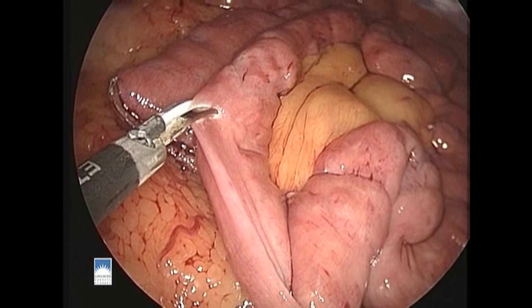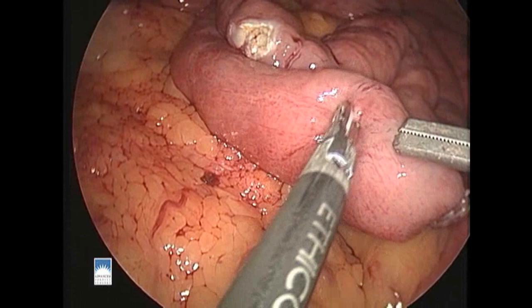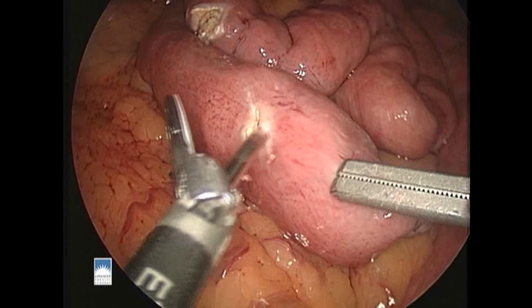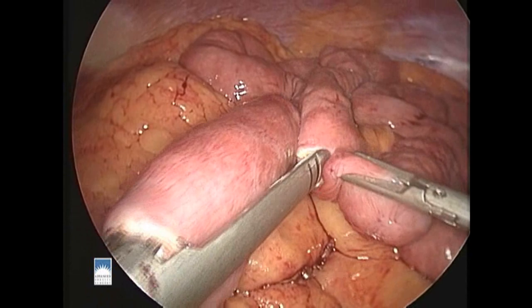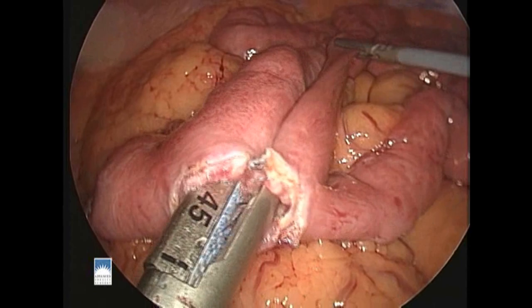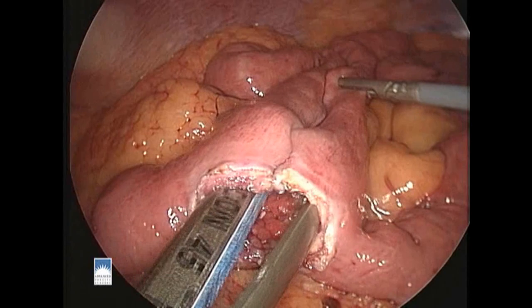Now we're ready to make our distal anastomosis. We make openings in each loop of bowel with the harmonic scalpel, making these openings as small as possible. We then insert the stapler into each opening in the bowel, one jaw to each opening. Firing the stapler so positioned will create an opening between the two loops of bowel. We then extend this opening with another firing of the stapler inside, one jaw to each side of each wall of the bowel.